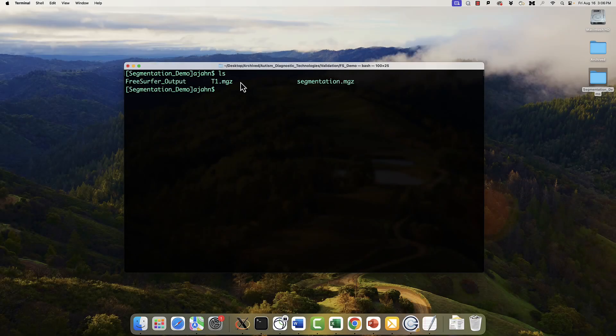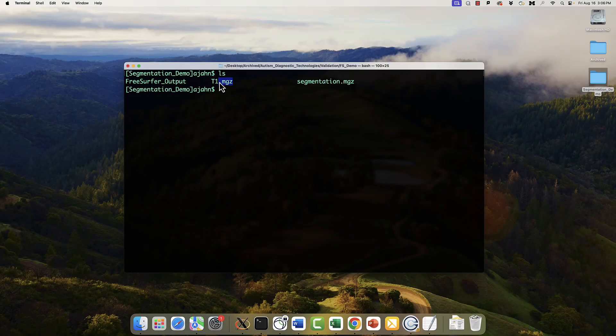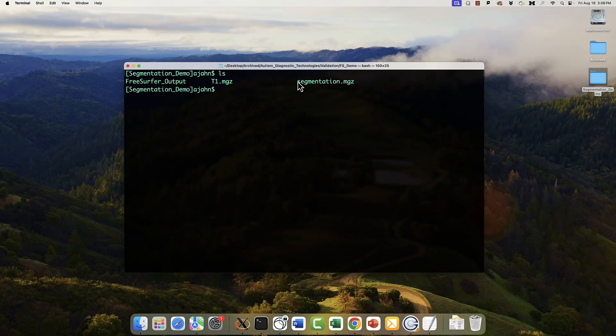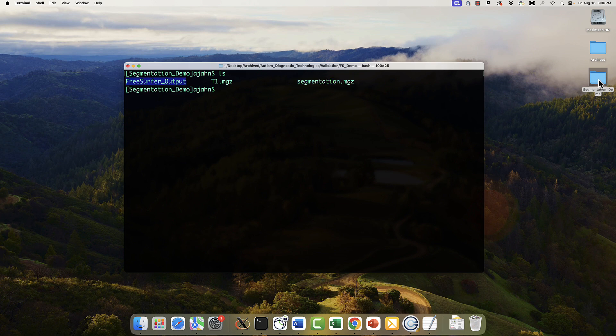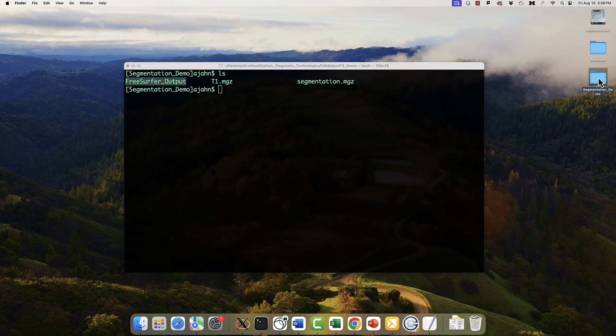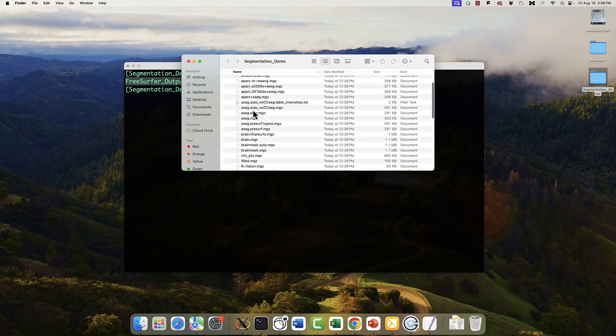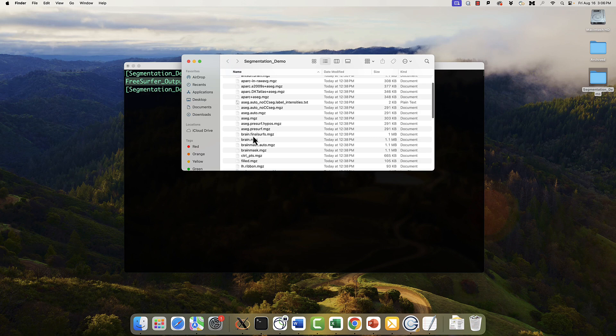In this case, in this directory, I have my raw T1 weighted anatomical image and a segmentation image, which I'll get to later. I also have the FreeSurfer output directory, which contains all the automatically generated files from FreeSurfer. For example, the aparc plus aseg.mgz image that's part of the MRI folder.